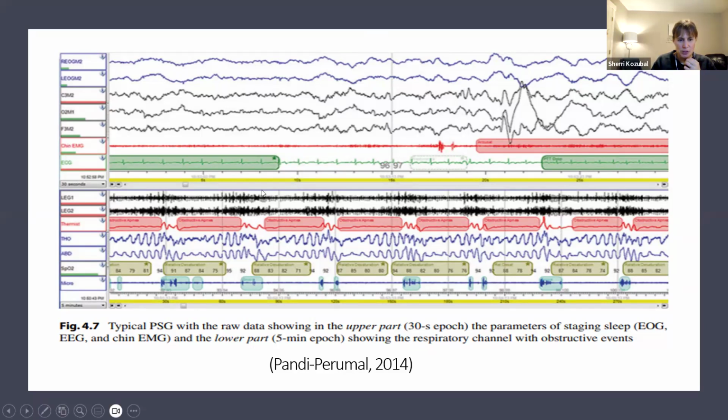So when we look at the impact on this particular person, you can see the oxygen levels being impacted. But you can see here, there's really not a lot going on. There's maybe a little bit of flattening and maybe a little bit of lightening of sleep, maybe some arousals in here, but very, very little actually. This person looks like they've been doing this a long time. What's happening is they're just coming up into perhaps a lighter stage of sleep before they get a couple of breaths and fall back into some deeper sleep, and then they do it again. So not a lot happening with this person in general.